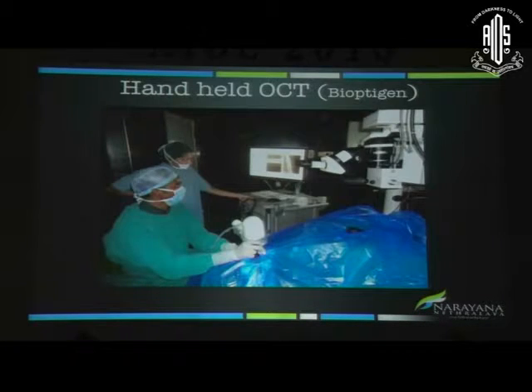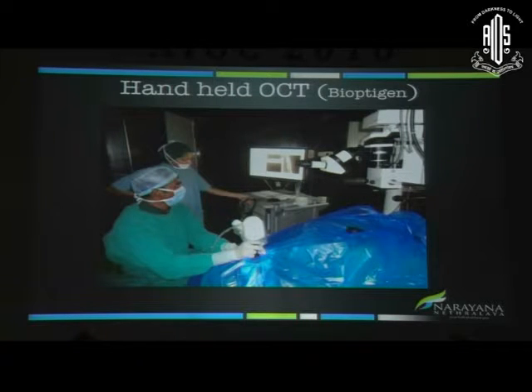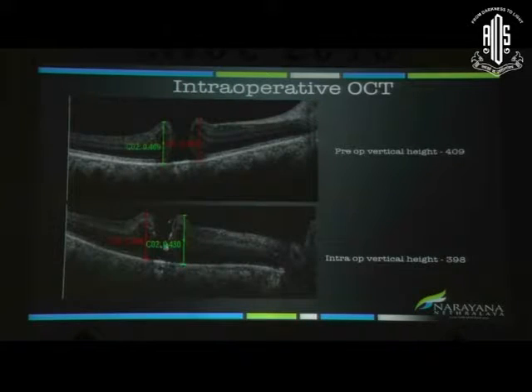So what happened over the last couple of decades is that OCT has basically revolutionized imaging of ocular structures and various disease conditions as well, and it has only recently found its way into the operating theatre. But early attempts at intraoperative OCT, the handheld ones, have already improved our understanding of surgical pathology and the role it may have in surgical decision making quite well. But there were always some problems associated with the handheld OCT in terms of it being a little cumbersome during surgery and also some sterility related issues.